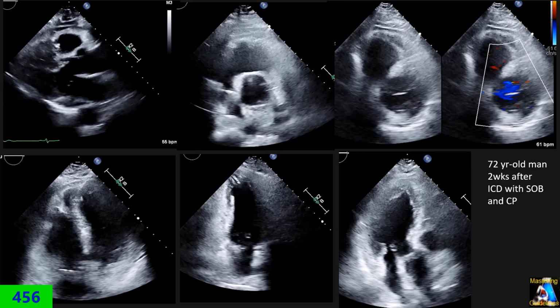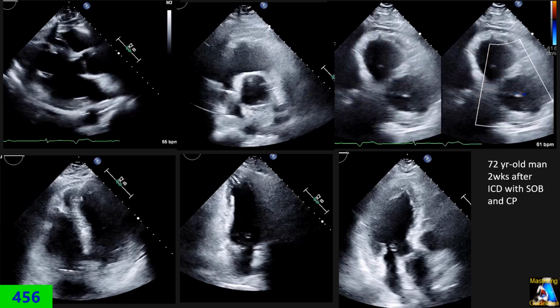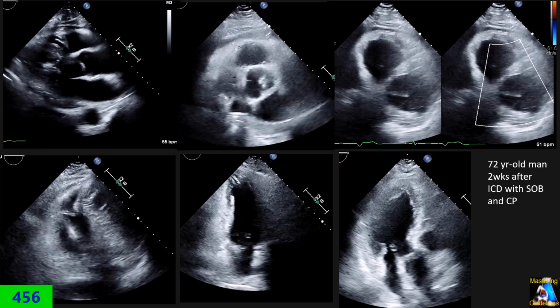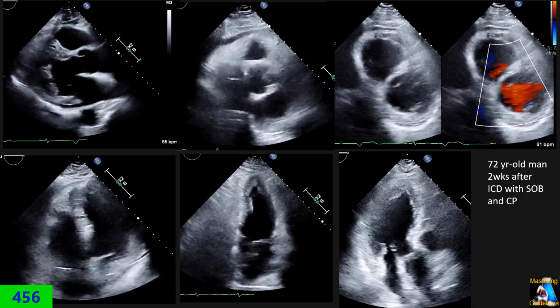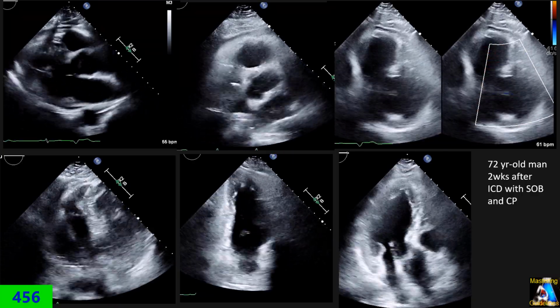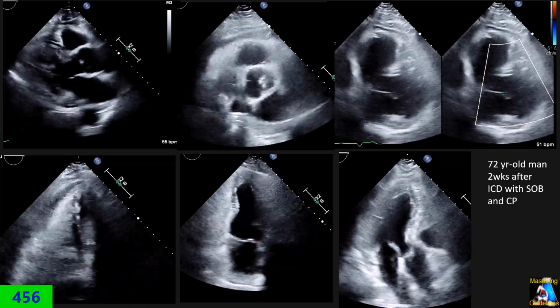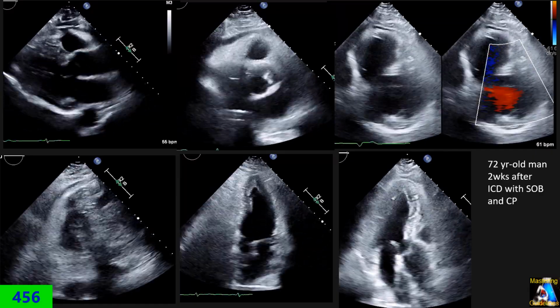Hi everyone. In this clip, I'm going to present two cases related to ICD and pacemaker complications, the most important complications of this type of device, and what we have to think about and be aware of when we are scanning this group of patients.